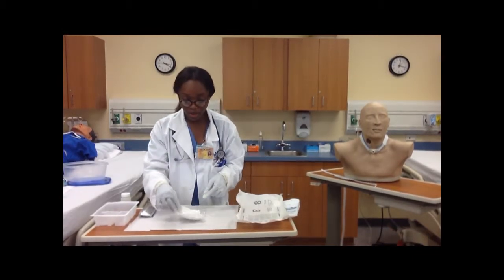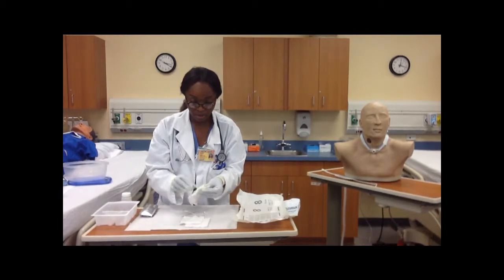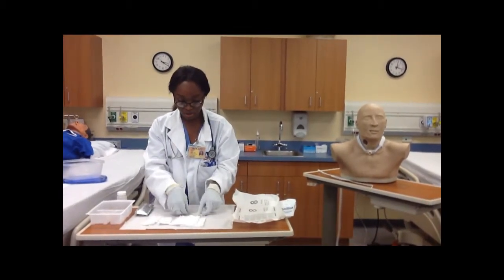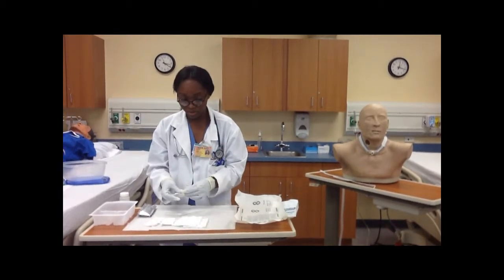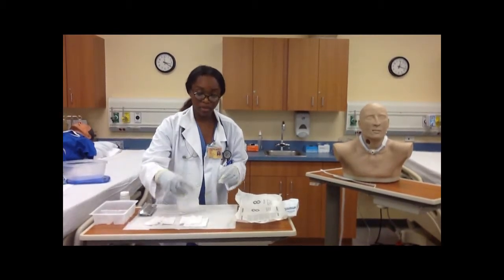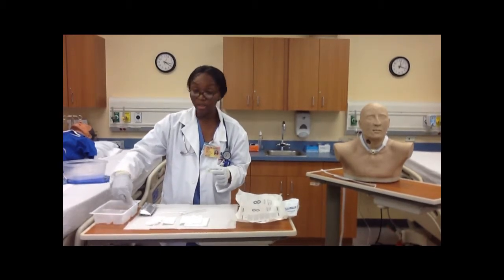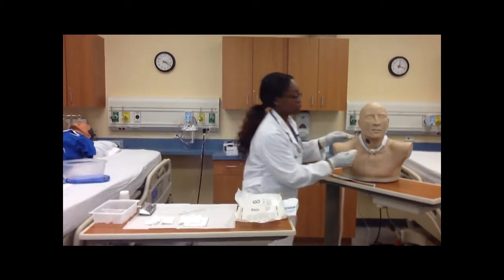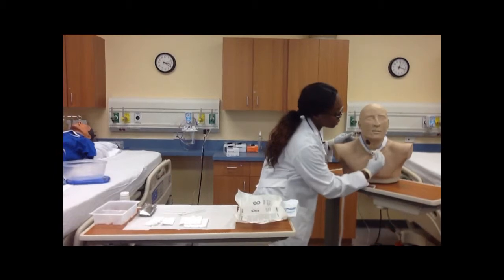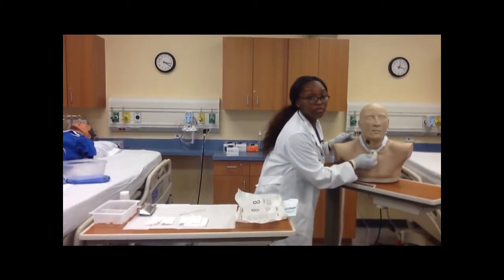Now, here I have three 4x4 gauzes, and I also have two cotton applicators. I'll take my first gauze, and I will dip it into the peroxide and saline water solution, squeeze out the excess water, and I'll begin by cleaning around the patient's tracheostomy tube, which is the patient's flange.